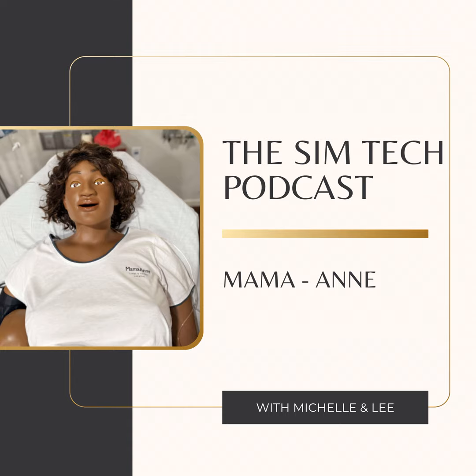So most of you in the simulation technician community will be familiar with Laerdal products, or hopefully you have, and Mama Anne functions from LLEAP software. So again, if you're not familiar with LLEAP software, if you end up having a Mama Anne simulator, you'll cover all this sort of stuff on a getting started course that we would deliver with Mama Anne. So the first thing when you log on to LLEAP, it'll ask you if you're running manual or automatic mode.